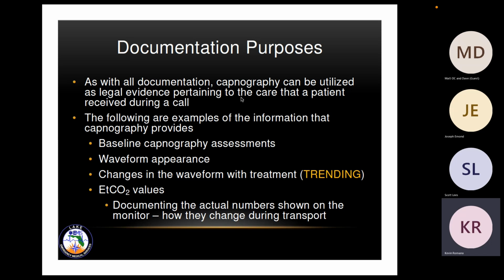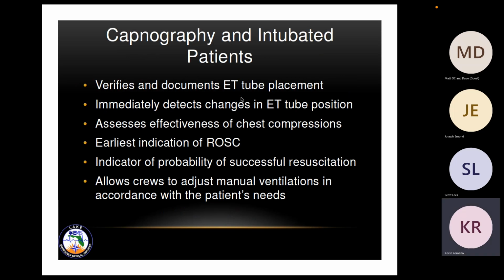And when you upload stuff to EasyPCR, your end tidal waveform also gets uploaded to the PCR program, along with your numbers. Your waveform and your numbers both get uploaded. Documenting the actual numbers shown on the monitor and how they change during a transport. There's no faking this. You can go in there and edit the numbers if you really wanted to, but you cannot edit the waveform. It's there. So it's a good purpose for documentation.